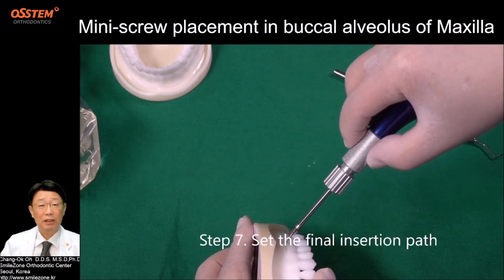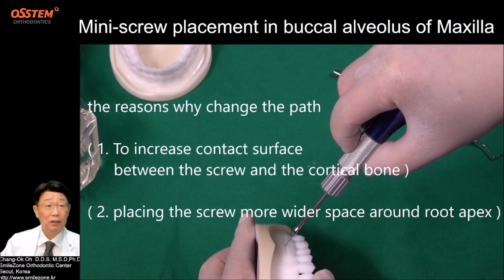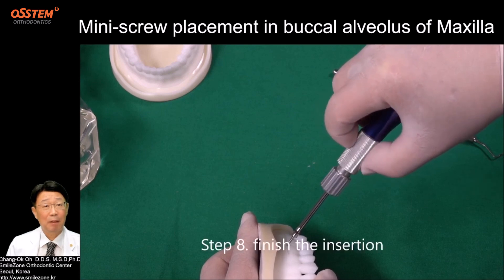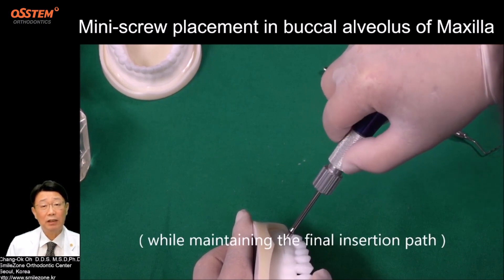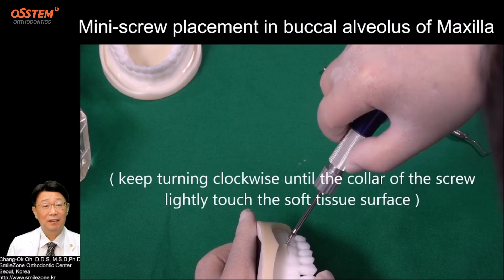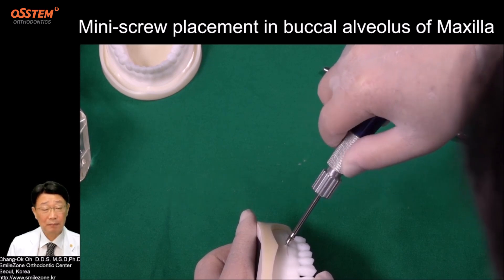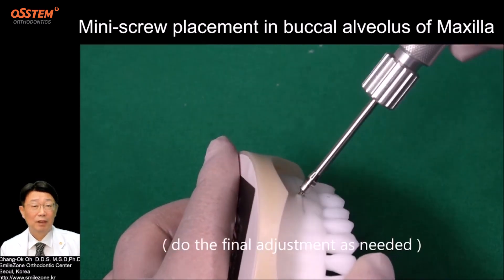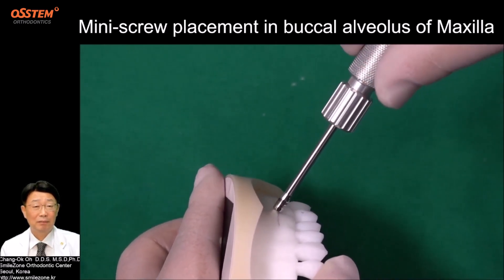Step 7: Set the final insertion path — change the occlusal-gingival path apically 20 to 30 degrees. The reason for changing the path is to increase contact surface between the screw and the cortical bone, and to place the screw in a wider space around the root apex. Step 8: Finish the insertion while maintaining the final insertion path, turning clockwise until the collar of the screw lightly touches the soft tissue surface. Step 9: Do the final adjustment as needed.